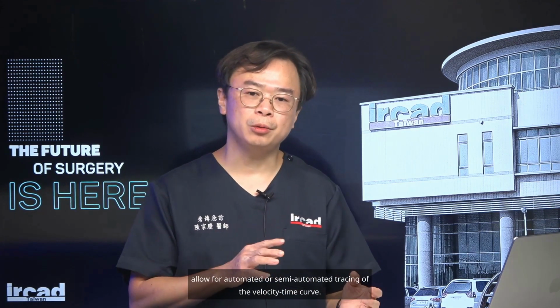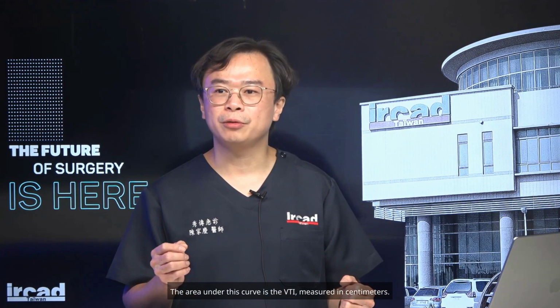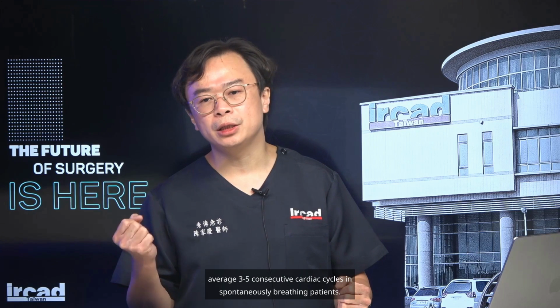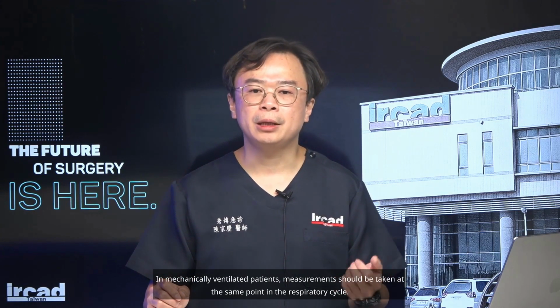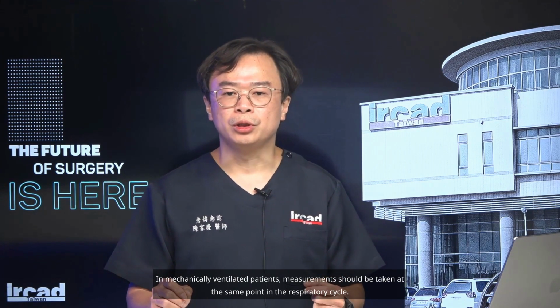6. Trace the velocity time envelope. Most modern ultrasound machines allow for automated or semi-automated tracing of the velocity time curve. The area under this curve is the VTI, measured in centimeters. 7. Average multiple measurements. To account for respiratory variation, average 3 to 5 consecutive cardiac cycles in spontaneously breathing patients. In mechanically ventilated patients, measurements should be taken at the same point in the respiratory cycle.